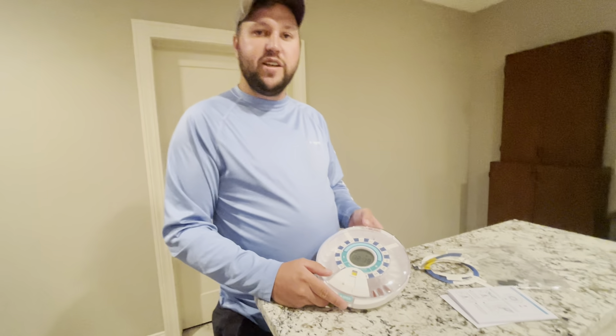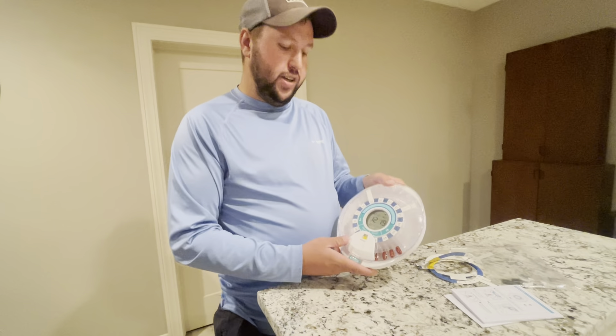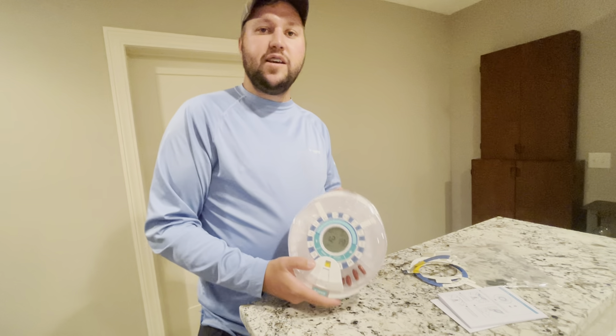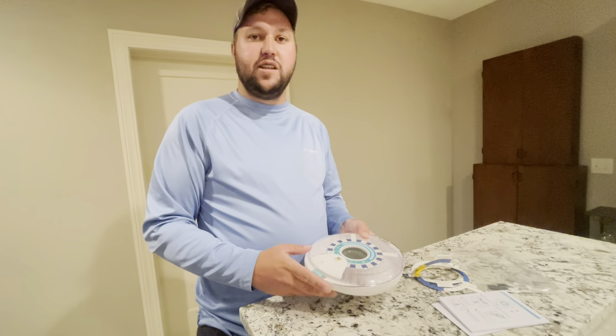Hey guys, James here. Wanted to give you guys a review on this Smart Pill Dispenser. This was given to me in exchange for an honest review, so let's get into all the details.